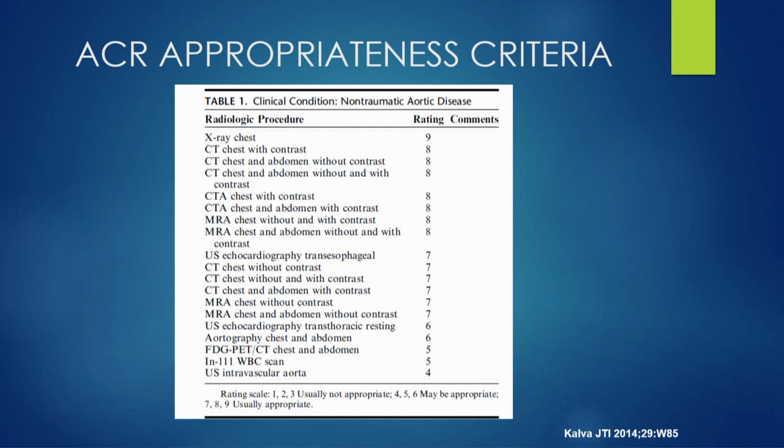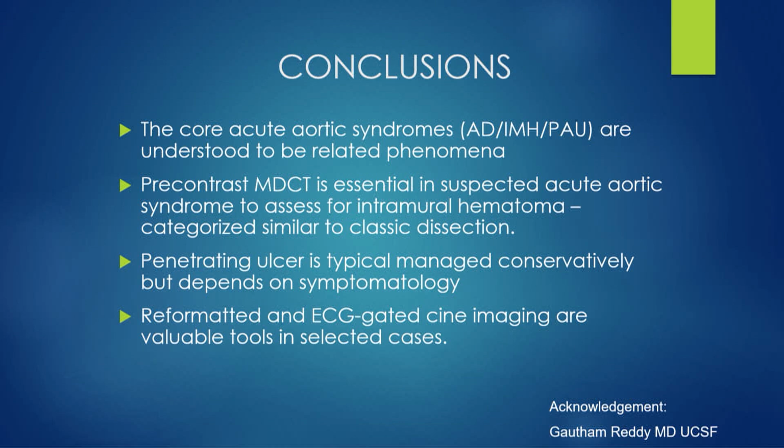And obviously, you can get the abdomen to see the full extent if it's going down to the iliacs as well.